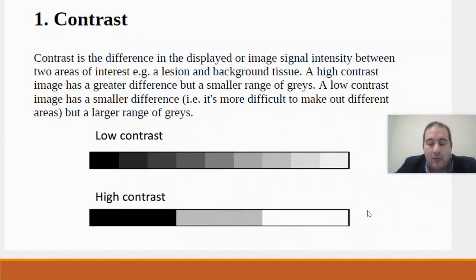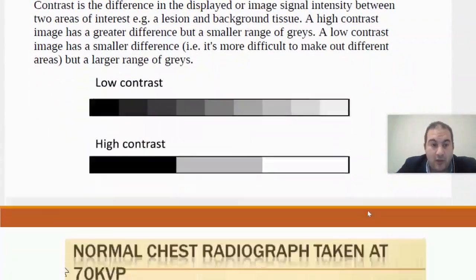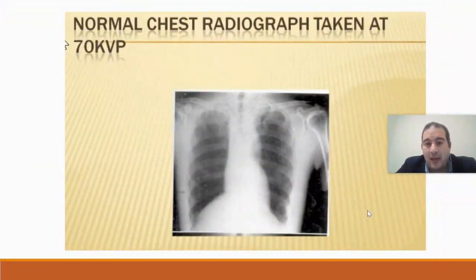If there is underexposure or overexposure in screen film radiography, you cannot do anything about it. However, if you are working with CR or digital radiography, you can make changes known as windowing, and you can enhance the image quality, allowing you to diagnose the image.